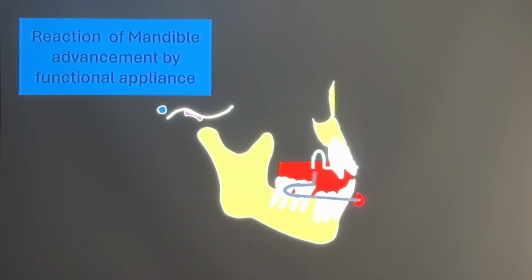Please check here, then check the occlusal surface and keep the touching area, still keep here.